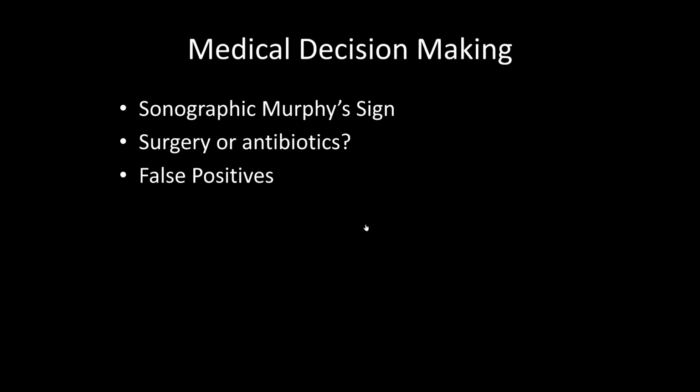Polyps can often mimic stones, and thus, without a shadow, the patient should be asked to roll onto their side to see if the structure is fixed or mobile. Stones will be mobile, whereas polyps will be fixed.